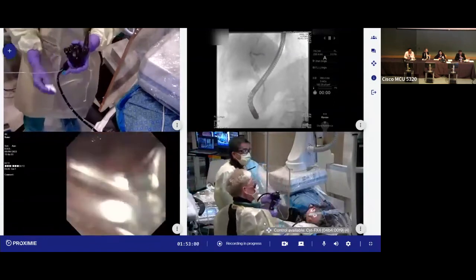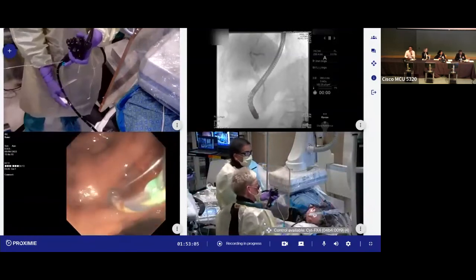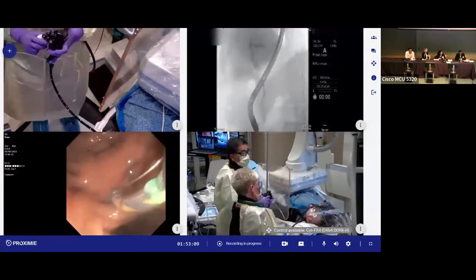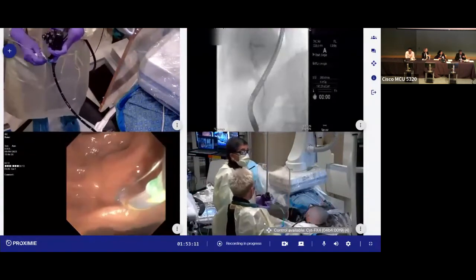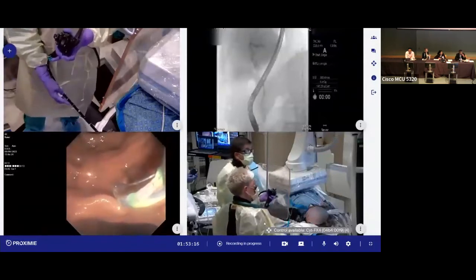Okay. So Raj, can you just tell us what your strategy is? Are you planning on doing a complete sphincterotomy or leave enough room for a large papillary balloon dilation? I'm sure you've thought of all of that with these many stones that were identified. Very good point. I'm glad you brought that up.